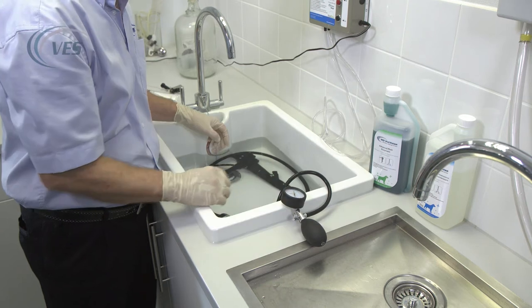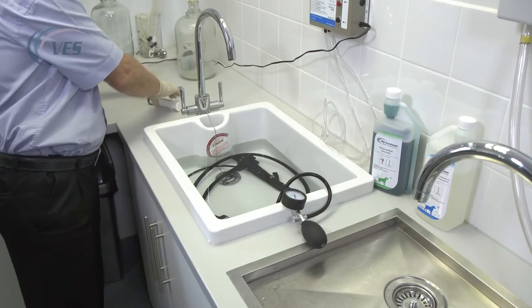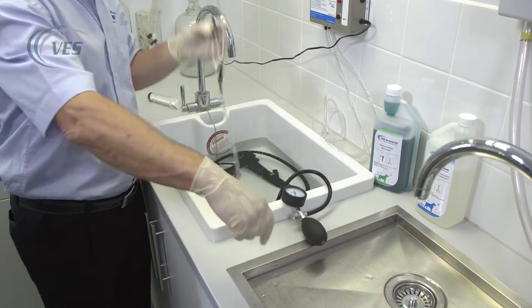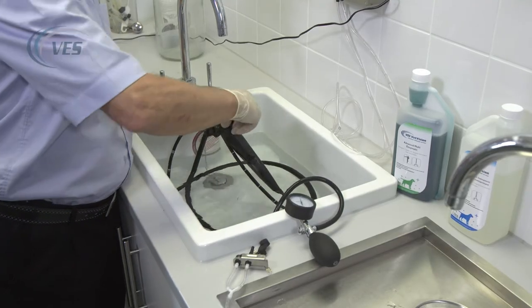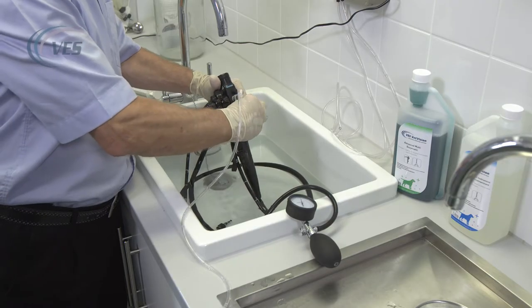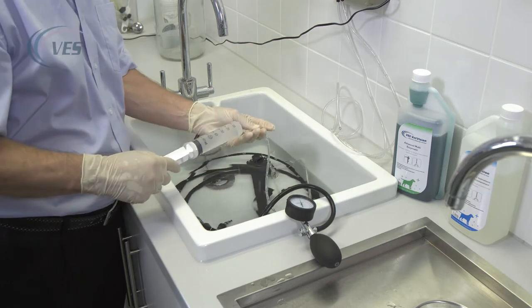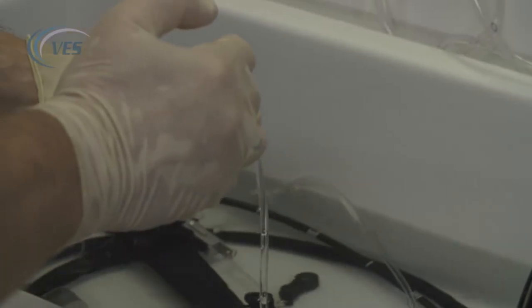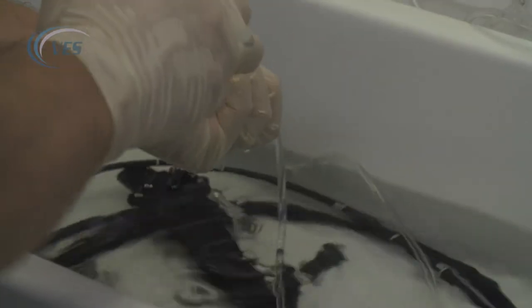If the pressure does start to drop and drop in a hurry, please remove the scope from the chemistry as soon as you possibly can. The first thing we're going to do is flush through the scope with the enzymatic cleaner. To do that, we're going to remove the blue and the red buttons — just place those in the enzymatic — with the long stem fitting in the blue port and the short stem in the red. Simply press down and push forward, and taking a large 60 ml syringe, suck up the enzymatic and flush it through a good two or three times until there are no air bubbles coming out and you're just getting a steady stream of chemistry coming through the scope.